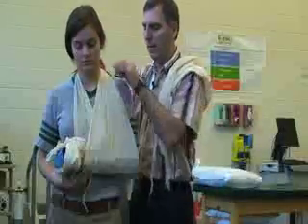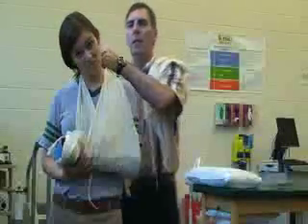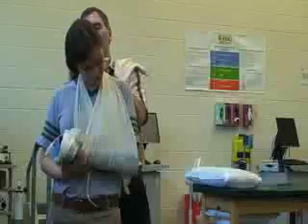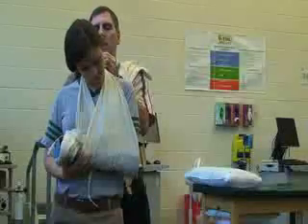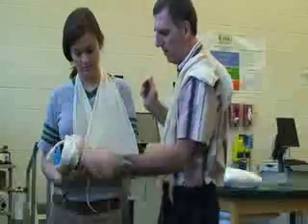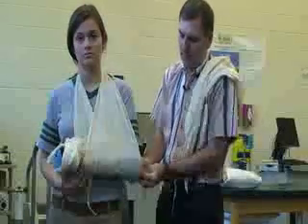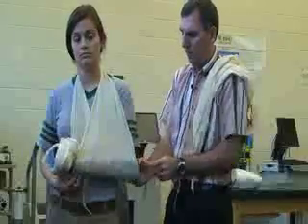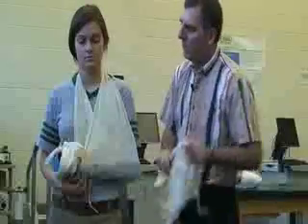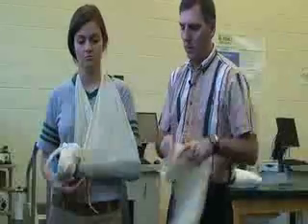Go ahead and hold it, Katie. I'm going to bring it up a little bit. With our gauze, we would put a gauze pad underneath the knot in the back of the neck. Once we have that, we're going to pin off or tie a little knot here in the corner. That's the sling. Now we're going to put the swathe on there to help keep it close to the body, because right now she can move it away from the body, which is not good.